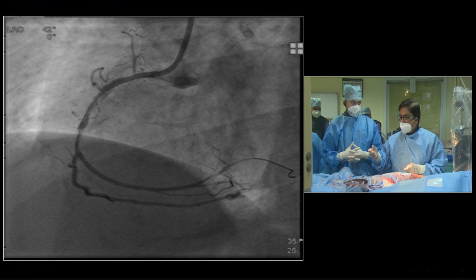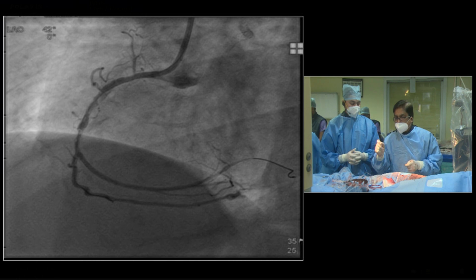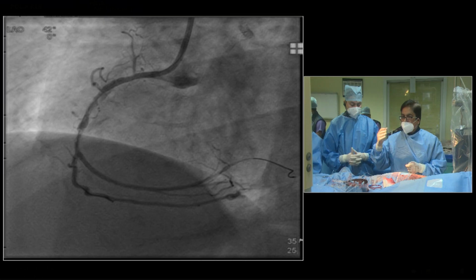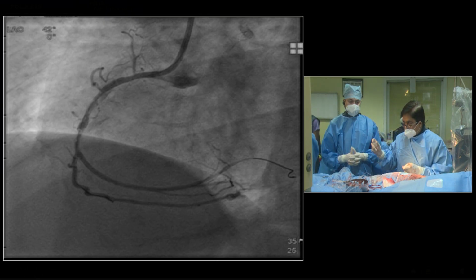And it is giving us a straight line equation, y is equal to mx plus c. So the equation for the 3 is slightly different, but practically I'll tell you what it is. The true size is 0.75x plus 1.05. Now you can understand that. I'm making a rough thing out of it, but there are 3 equations which I have published there.